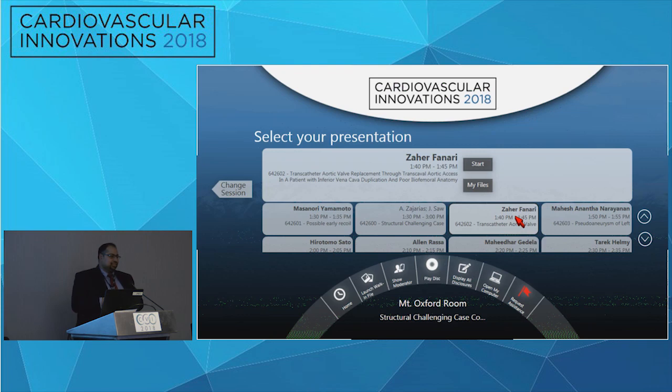No, that's a very difficult case that you guys tackled. It becomes more and more apparent that the more patients we treat, the more patients have so many other comorbidities that you try to do your best to make sure you treat the one thing that you can. We've also tried to avoid the inguinal area for patients who are morbidly obese, because they can be more prone to infections or things of that nature. But I think this was a very good case. Congratulations. Thank you very much.